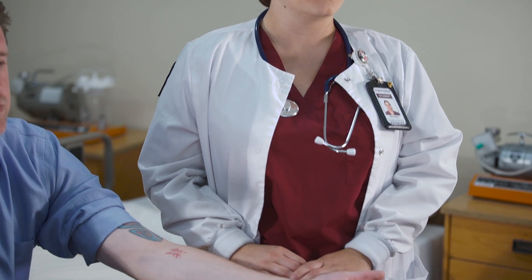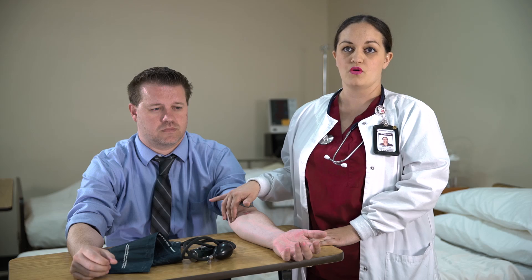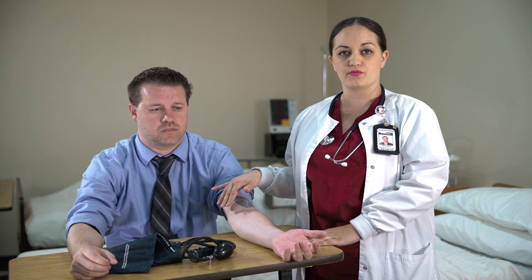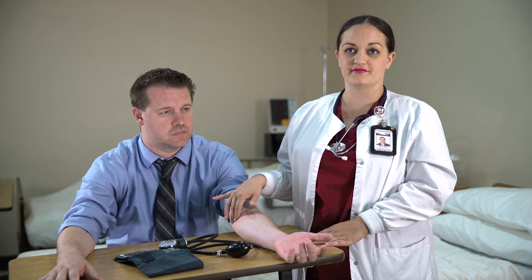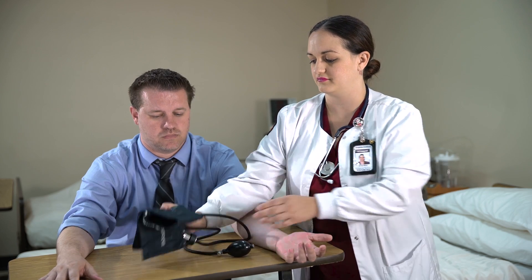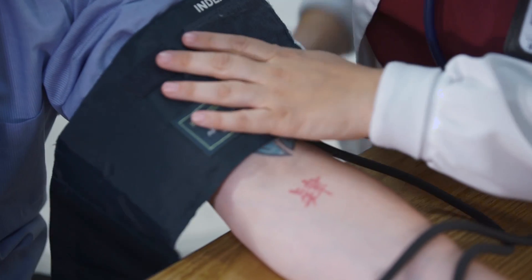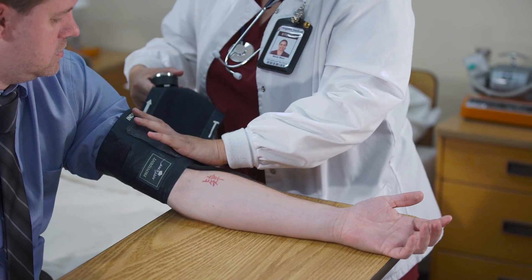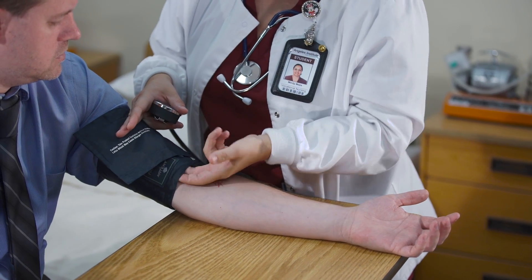The bladder of the cuff should be completely deflated. Feel for the brachial artery located in the antecubital fossa, which is located in the inner arm where the bend of the elbow is. Once the artery is felt, you can apply the cuff one inch above the antecubital fossa, tight enough to where there is a two-finger space. The midline of the cuff should be lined up with the arterial pulsation.